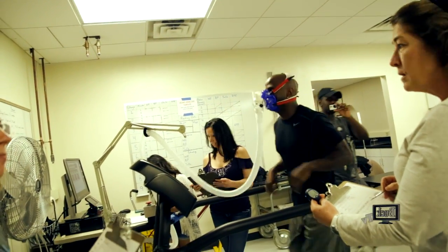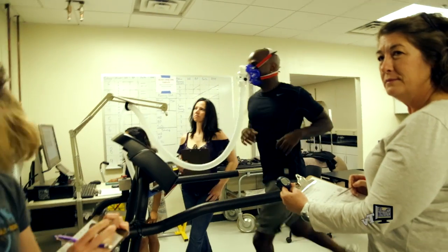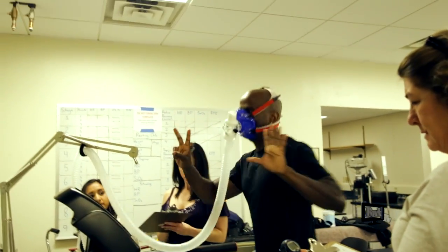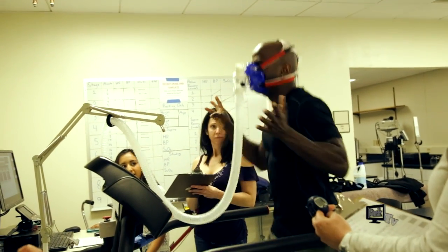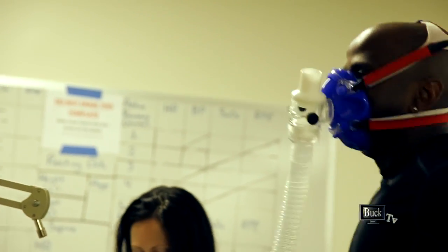Laura, tell us what RPE stands for. Rating of perceived exertion. Yeah, I remember that. So rating of perceived exertion is how does he feel? He just told us this is a 6. So even though his heart rate says 177, we're like, oh, he's at a 6. Oh, he's at a 7. Okay, he's at a 7. I was like, well, how is he measuring that? But yeah, it's subjective. We may go, oh, he should be at a 12, and he goes, no, I'm at a 6. We can't argue with that. That's his rating.